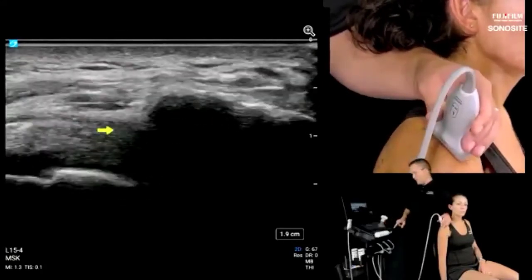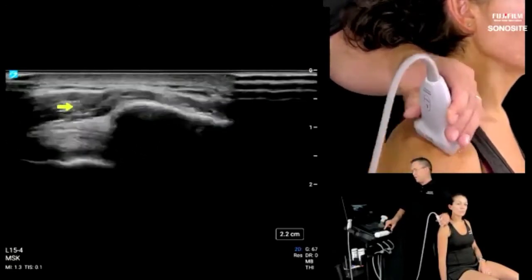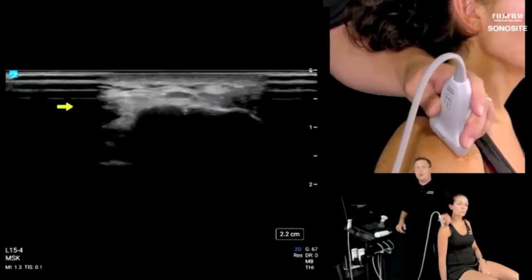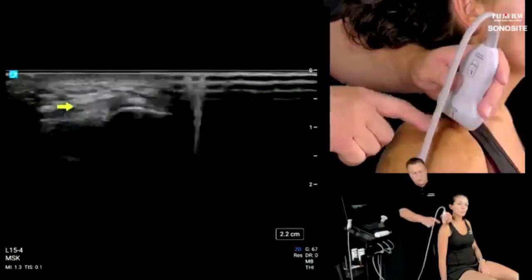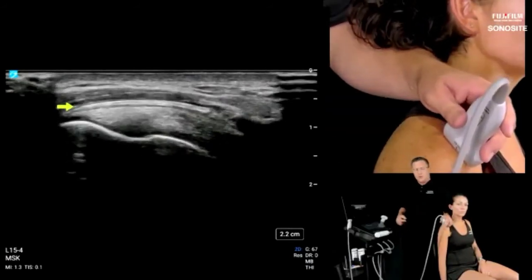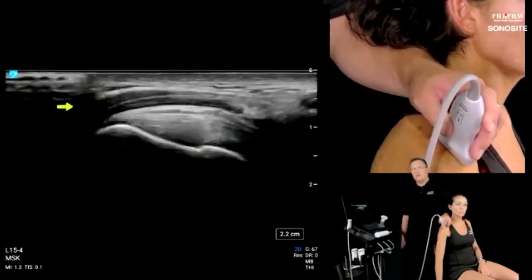Another scanning tip, if you're in this area, is to put the weight of the transducer right up here on the acromion. Don't put the weight of the probe on the deltoid. So we covered that in the lateral shoulder webinar at depth. We actually went over lots of scanning techniques for doing the subacromial, but I will say real quickly while we're here, if the weight of your probe is on the deltoid too far laterally, when she abducts, the contracting deltoid is actually going to bump my transducer and make it very hard to follow.